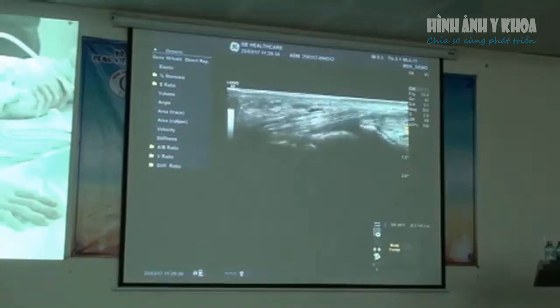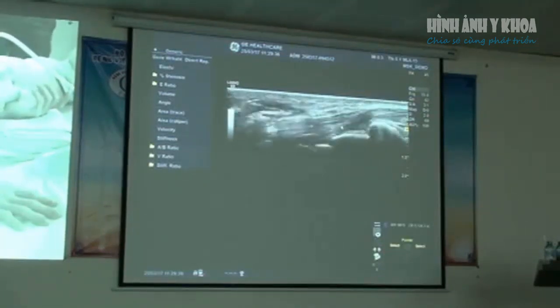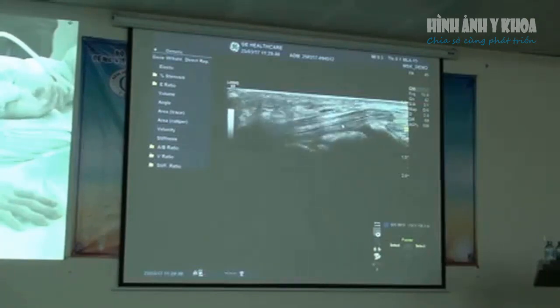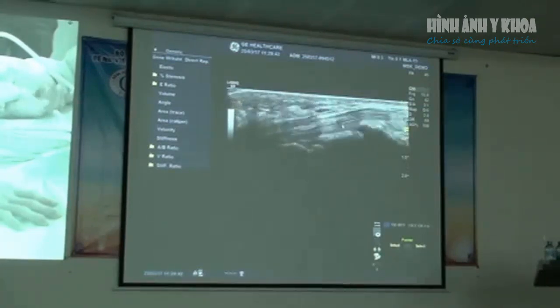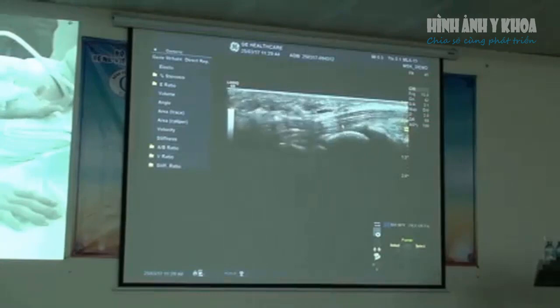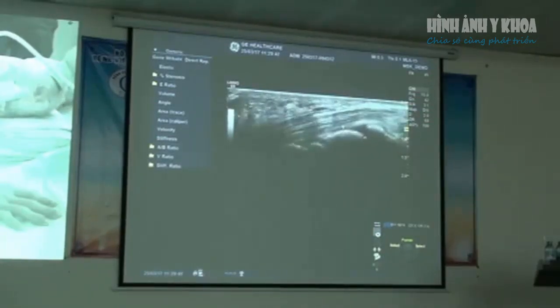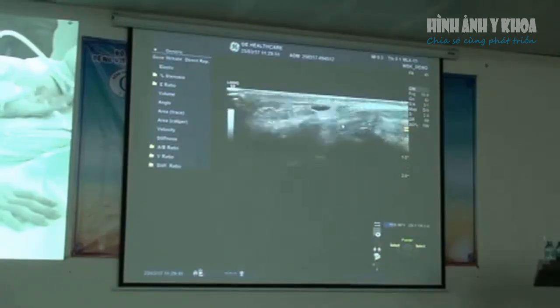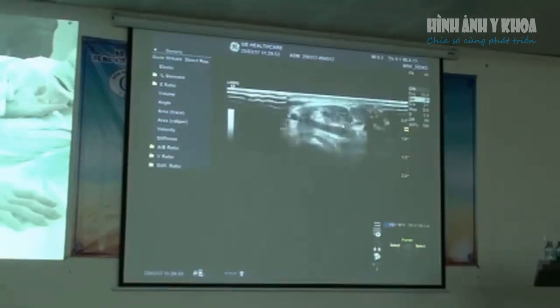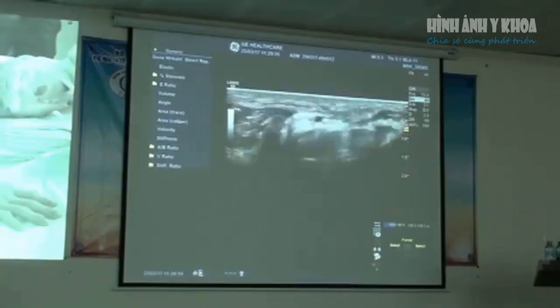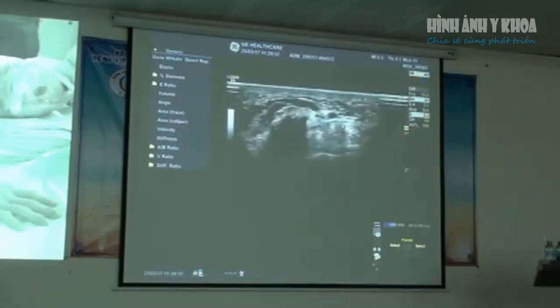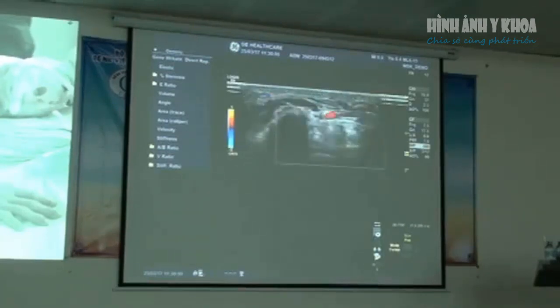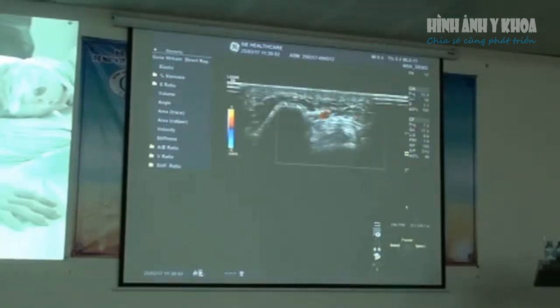These are the flexor tendons underneath the median nerve. Just wiggle your fingers — do a big move. We just watch the smooth movement of those flexor tendons. We can also make sure there's no tenosynovitis down in the flexor tendons.